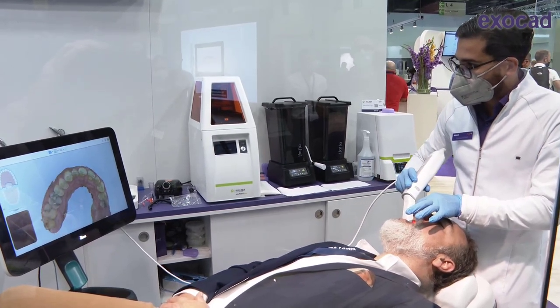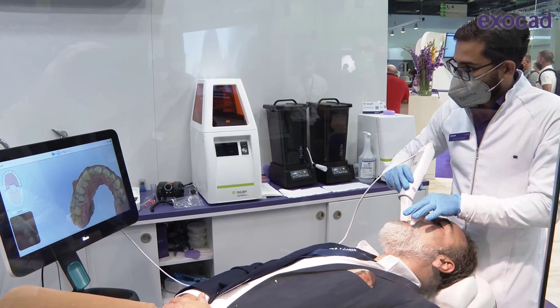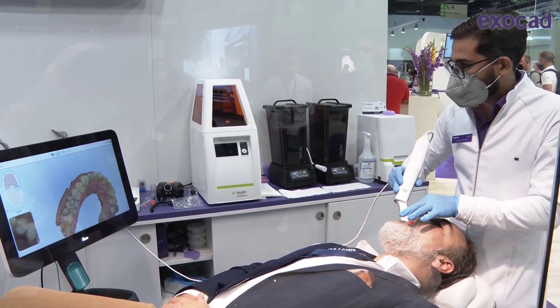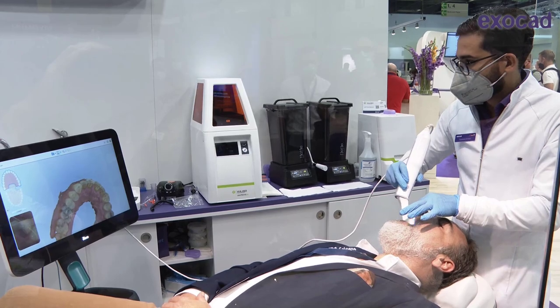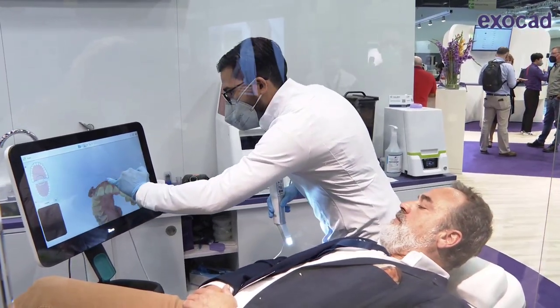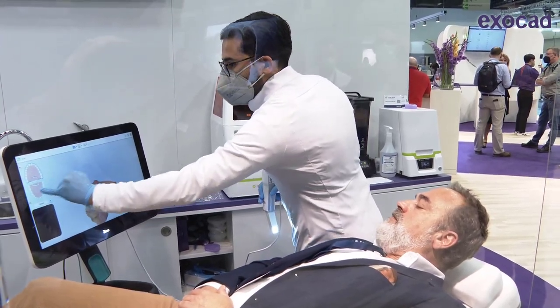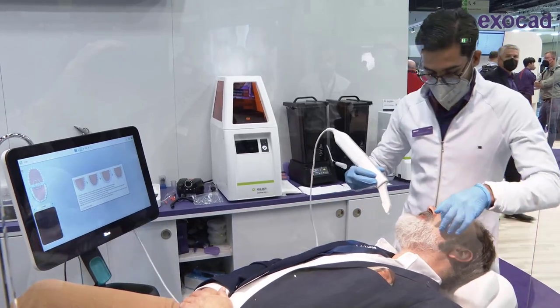If you notice on the scanner screen, you'll see that soft tissue — lip, tongue — and if a finger lands in front of the lens, it will be removed automatically by AI.